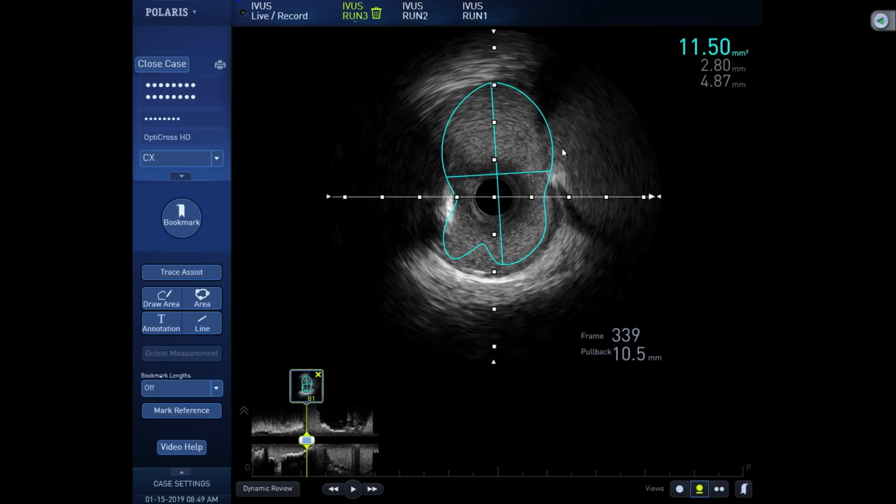We have to go into the LAD, right? Let's go to the same view. You don't like that view? No, I'll tell you what, the view, epicaudal then. Yeah, to me, this will be the view. Here. Okay, we are taking the picture.